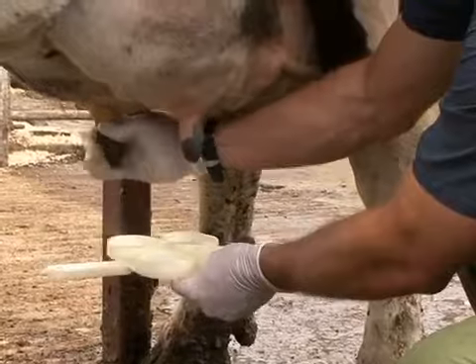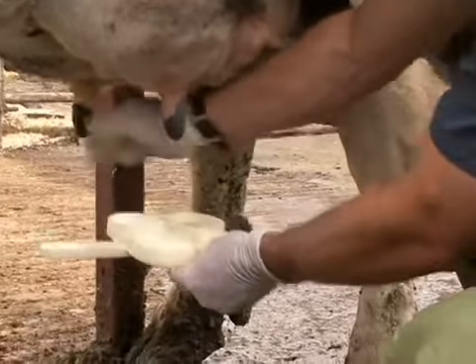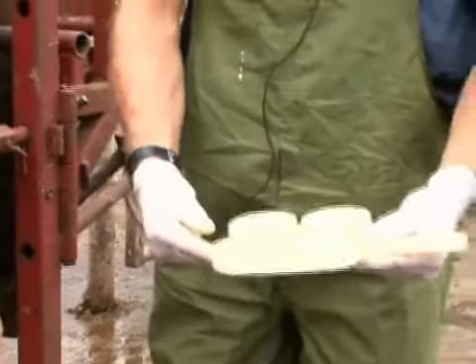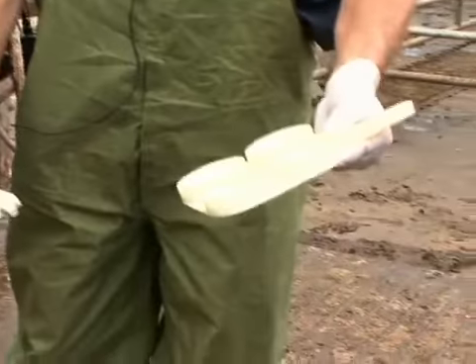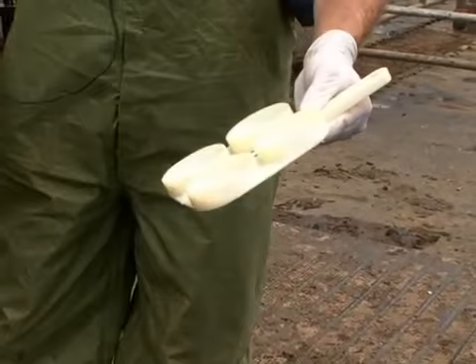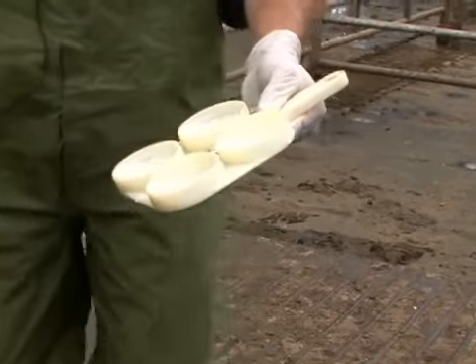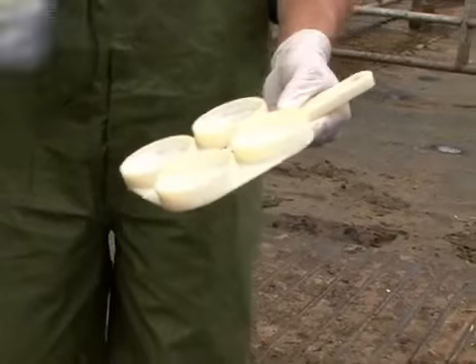Once we're finished adding enough milk to the receptacles, we will tilt this device over to the side. This paddle would be tilted to make sure we have an equal amount of milk in each well, and it looks like we have an equal amount of milk in each well.